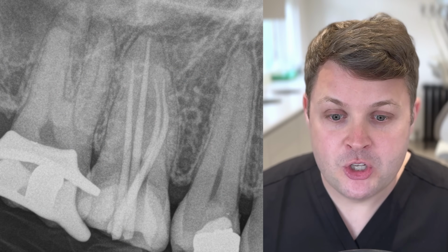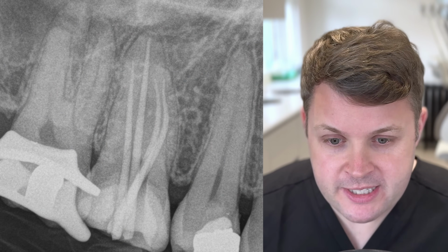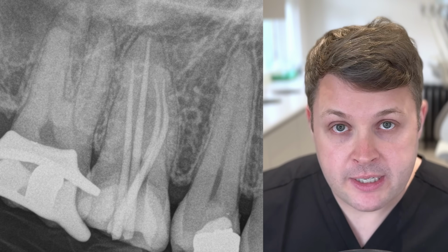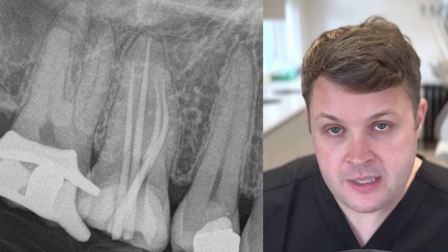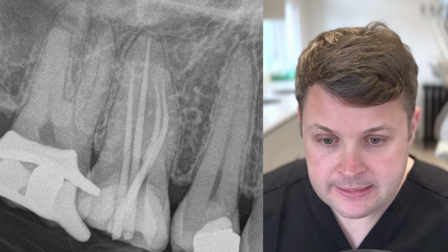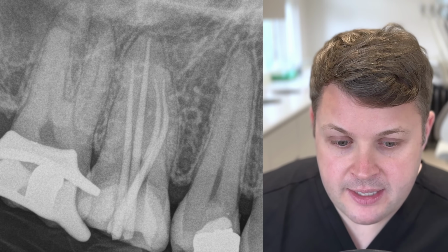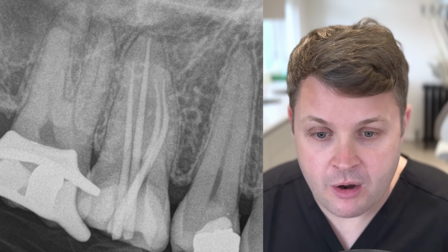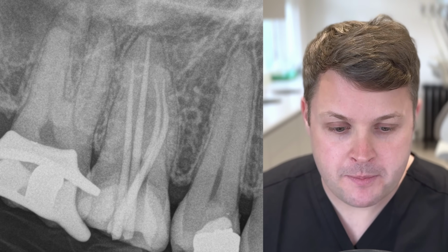And then obviously the nurse comes back. She shows me this cone fit radiograph and it looks absolutely fantastic. When we look at this X-ray, I'm convinced that the DB canal, despite the orifice being in an unusual position, is the DB canal. And then we can see here that the 2 MB canals are within the acceptable range of the radiographic apex.